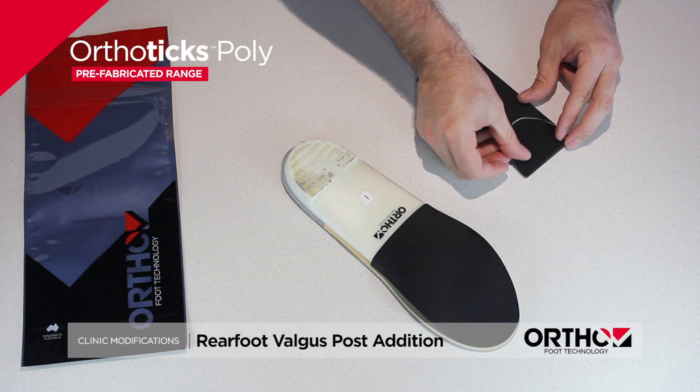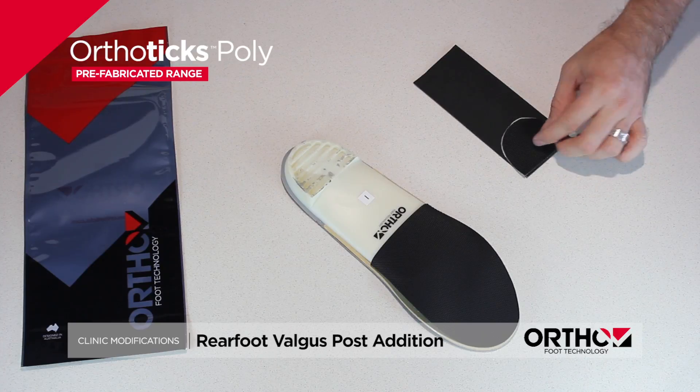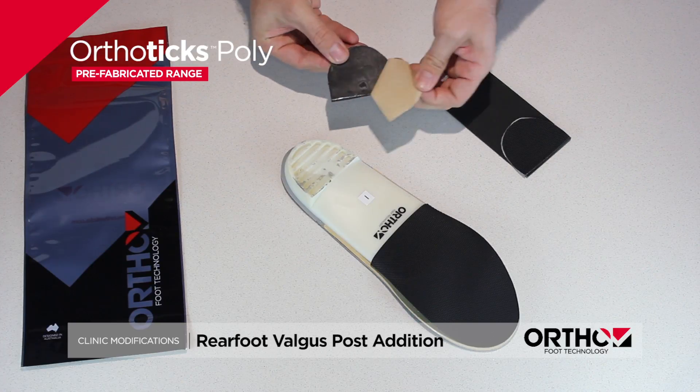Remove the scuff plate and use it as a template. Place a self-adhesive orthotics EVA wedge strip on the bottom surface of the orthotics poly, thicker laterally than medially.